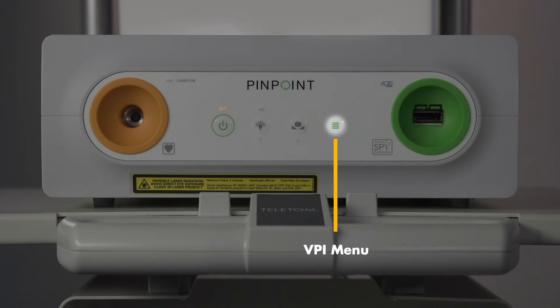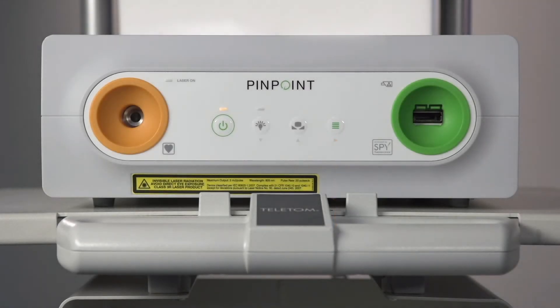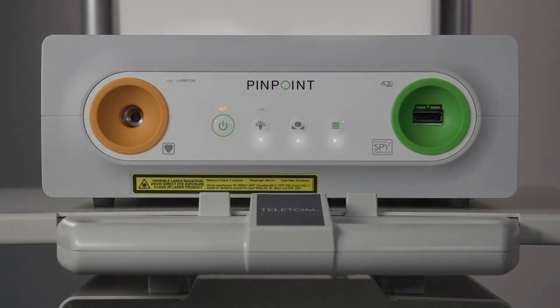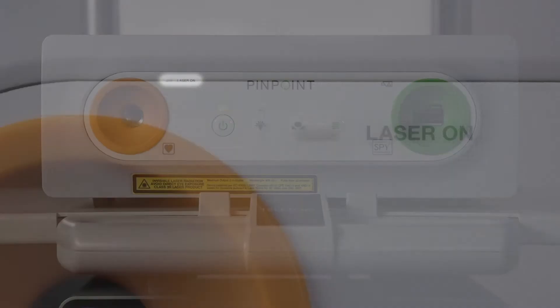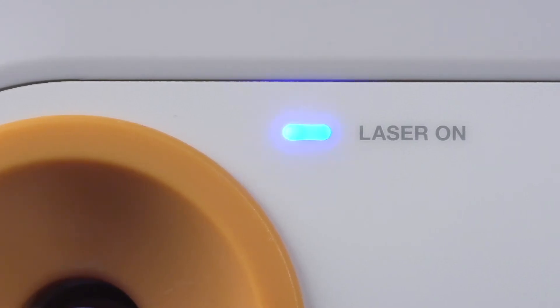The VPI menu can be accessed from either the SpyFi handheld imager or from the VPI. Once the menu is on screen, the arrows below the VPI buttons will illuminate and these buttons can be used to navigate the menu. Here is the laser on indicator. When you're in fluorescence imaging mode, this light will illuminate blue.